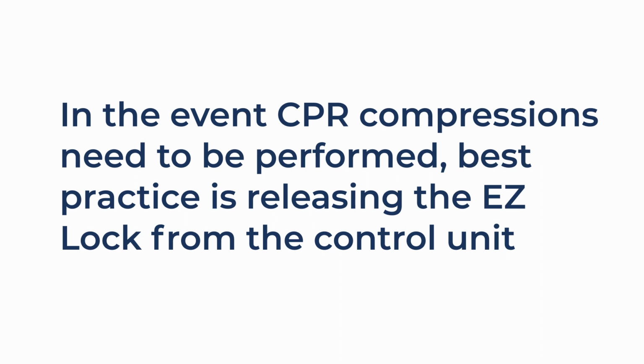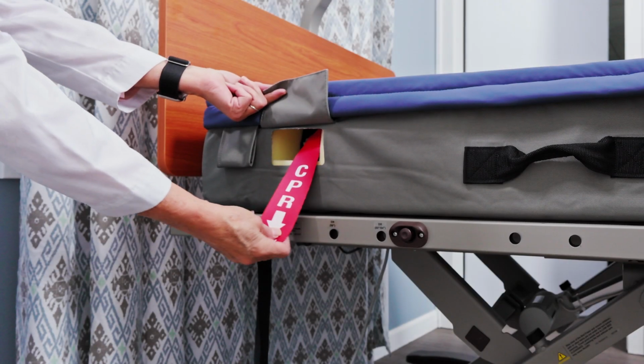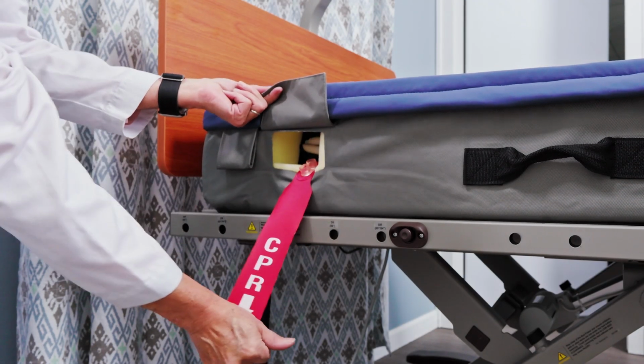In the event CPR compressions need to be performed, best practice is releasing the Easy Lock from the control unit and pulling the red CPR located near the head before beginning compressions.